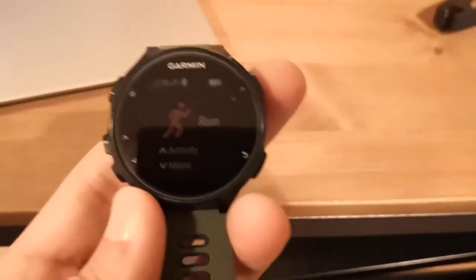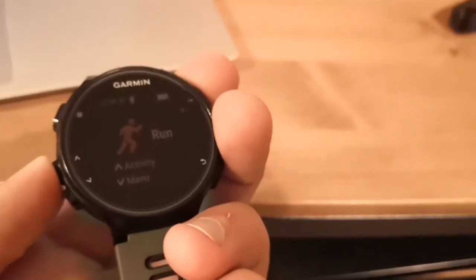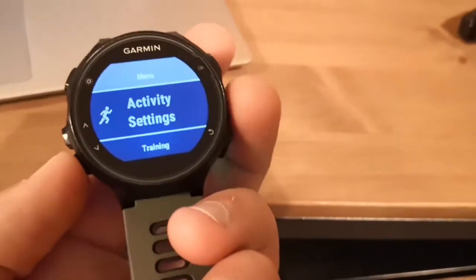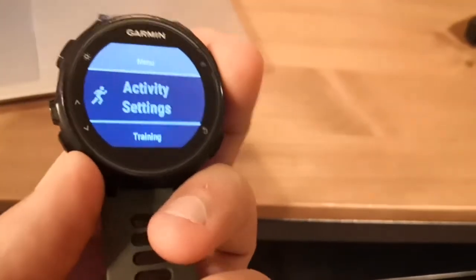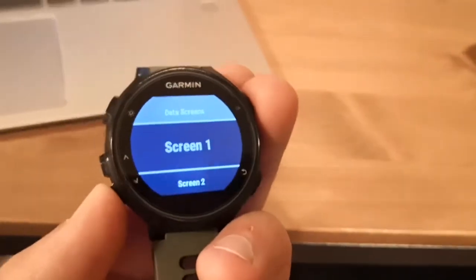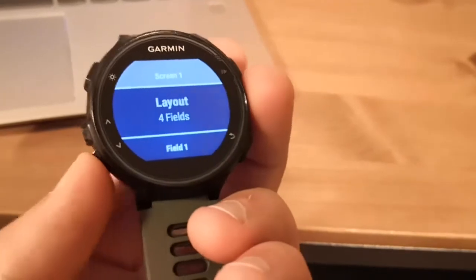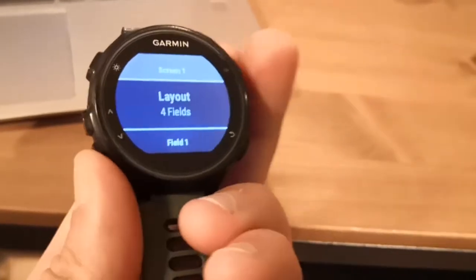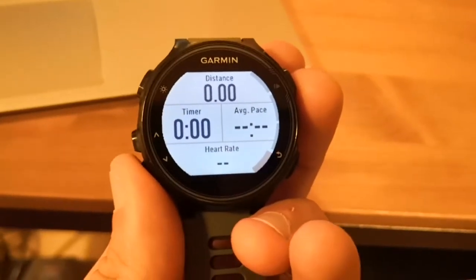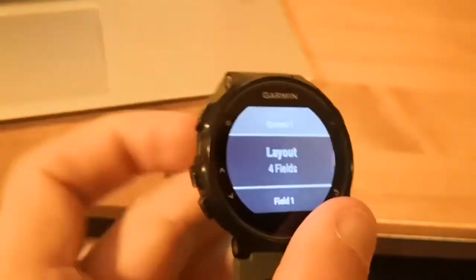So if you're setting up the data field for your run, you'll need to go to the menu, go to Activity Settings, then go to Data Screens. You'll need to select which data screen you want — in this case, it's going to be the xDrip app data screen. Let's check screen one: I've got my time, average pace, distance, and heart rate — that isn't the one I want.